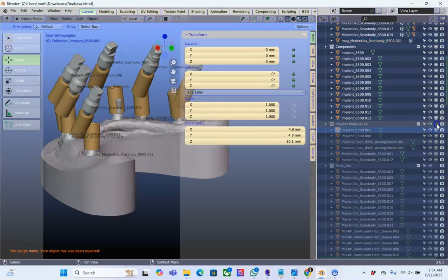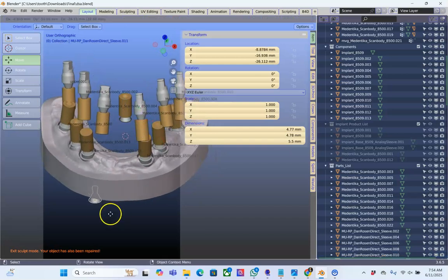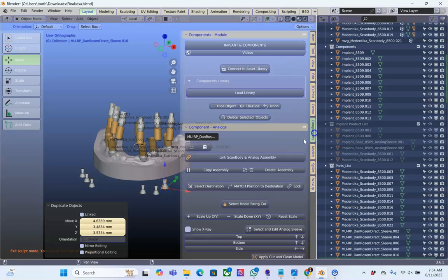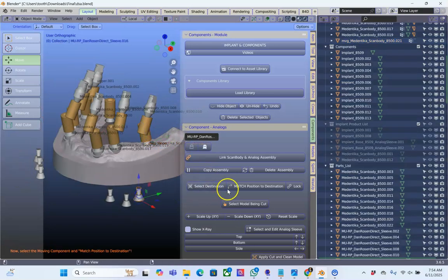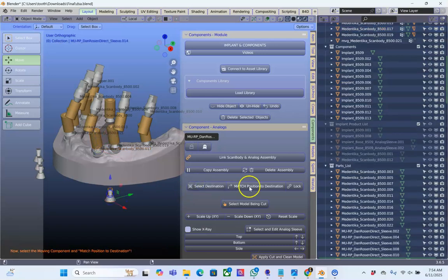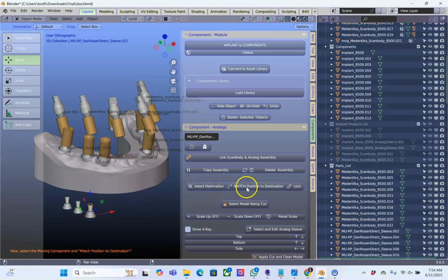Okay, so we're looking for the interface itself. Here, this one over here, this is the one we need. And we need a few of these. So Shift D. We need 3 on this side, and we need 3 on this side here. Go to the Components module, and this is the object. Select destination and match to destination. And we're going to do this for all of these. You see how cool it snaps into position. So always make sure you've got a coordination so that you can snap it to where it needs to go.